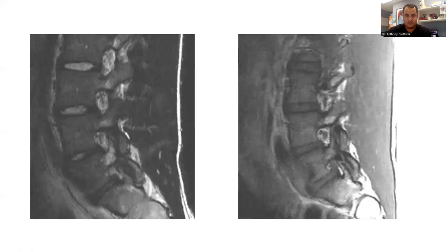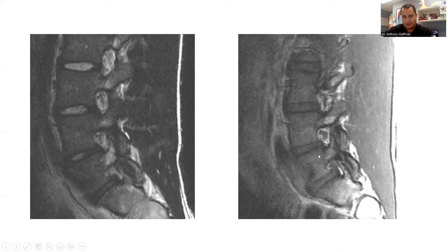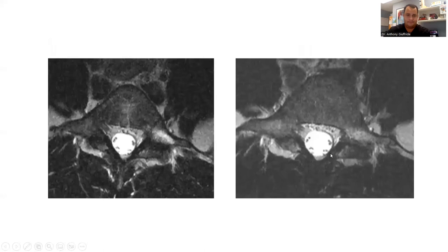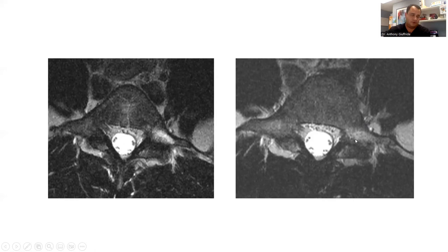We got a follow-up MRI, and you can see a lot of that edema is gone. He took some anti-inflammatories and really rested. I did put him in an LSO brace — I don't know if he wore it as much as we'd like; his parents said he wasn't great with it. But clearly a lot of that edema resolved, he was feeling great, and I told him he could return to play. He actually played in a few showcase games and felt great. The axial view of the follow-up MRI looks like it's healing very nicely.